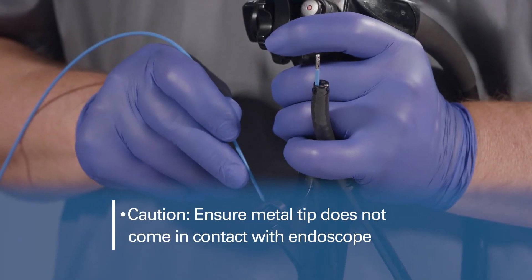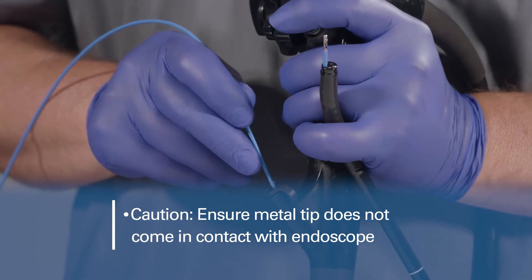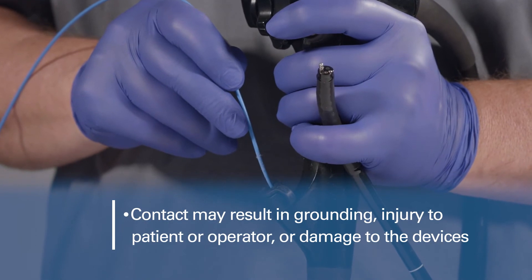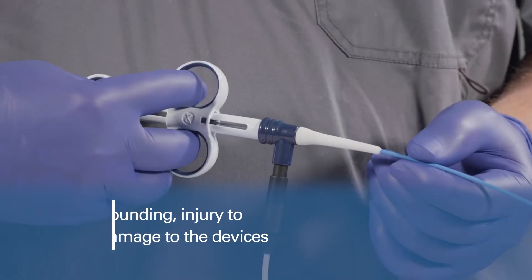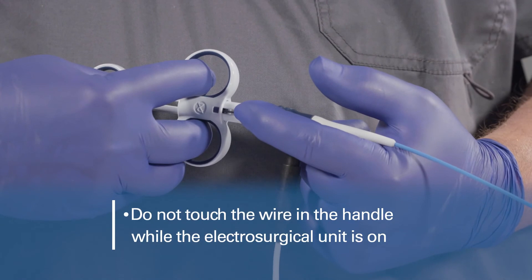Use caution. When applying the current, ensure the metal tip of the forceps does not come in contact with the endoscope. Contact may result in grounding, injury to the patient or the operator, damage to the endoscope, and damage to the forceps. Do not touch the wire in the handle while the electrosurgical energy is activated.